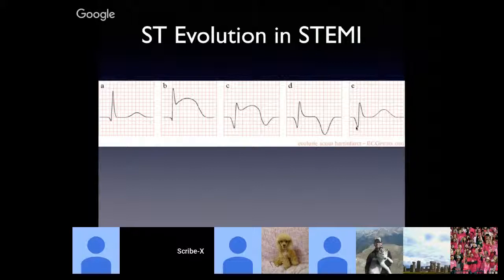But what's this that we see here? It wasn't quite as big here. What happens here is that our Q wave has become enlarged. What this means is that there's not enough heart muscle left to depolarize to create the tall R wave that this heart was used to.